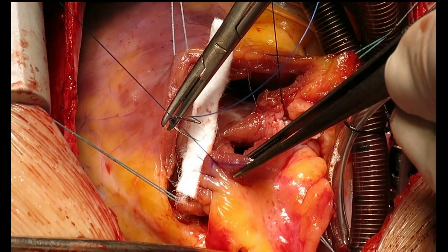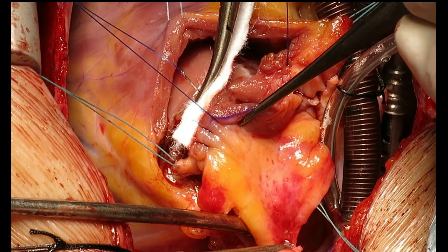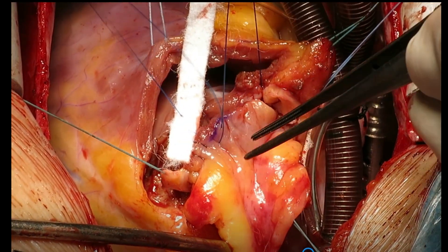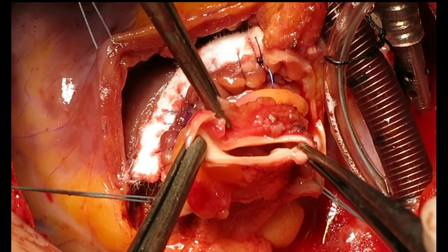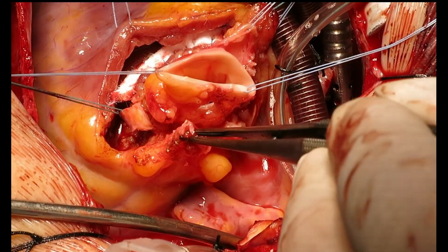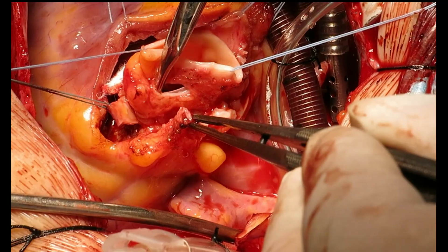The anterior suture line is reinforced with Teflon felt at the septal incision area where only muscular tissue is present. After observing anatomy and water testing to confirm proper leaflet function, we anastomose the left and right coronary buttons to their respective sinuses.